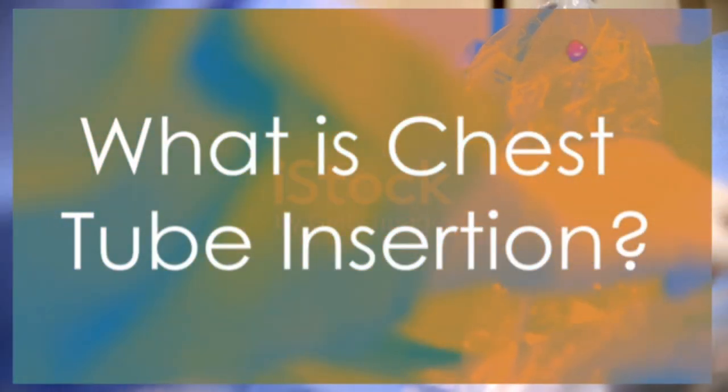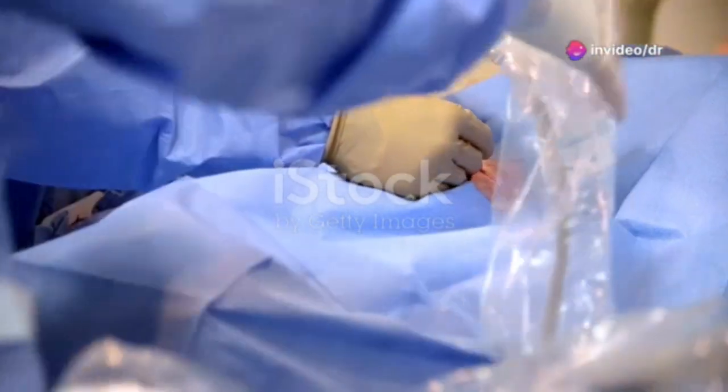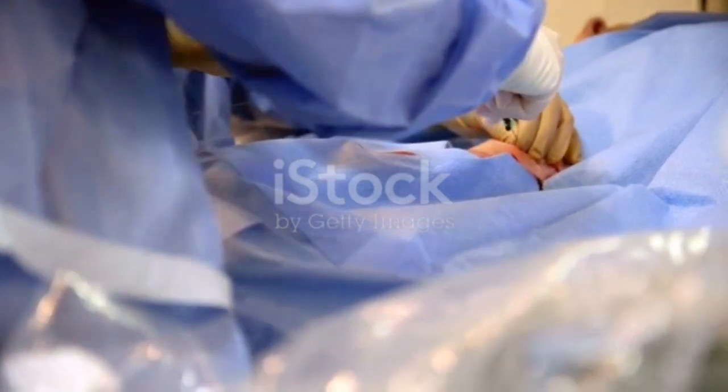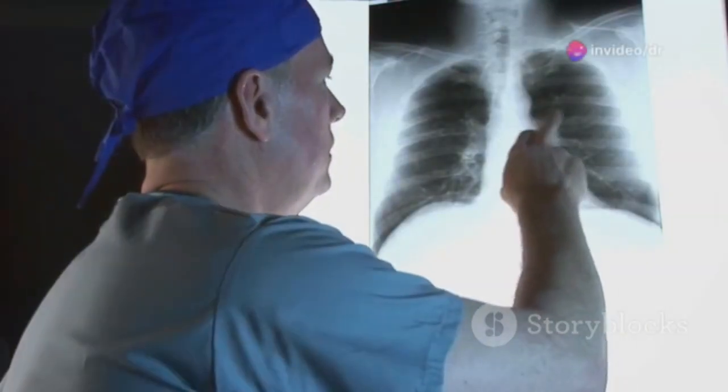Let us start. Chest tube insertion, also known as thoracostomy, is a medical procedure used to drain air, blood, or other fluids from the pleural space, the area between the lungs and the chest wall. This procedure helps re-expand the lungs and restore normal breathing.